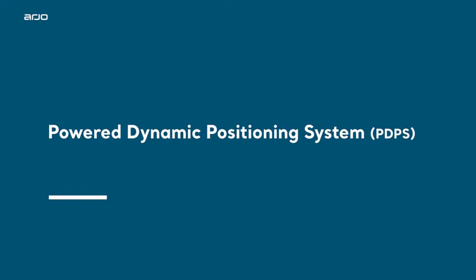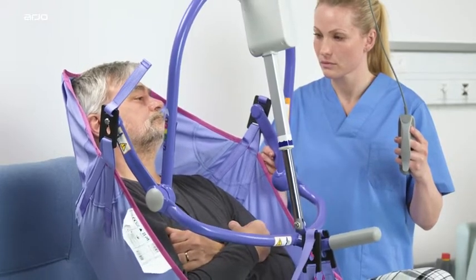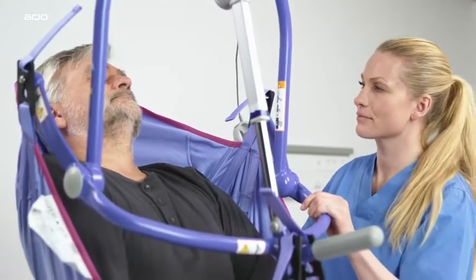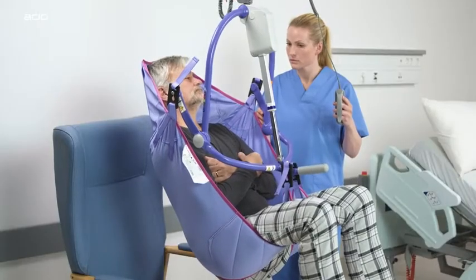Powered Dynamic Positioning System, PDPS. If you have a Maxi Sky Powered Dynamic Positioning System, or PDPS, press the image of the laying person to recline the PDPS, and press the image of the seated person to raise the PDPS to a seated position.